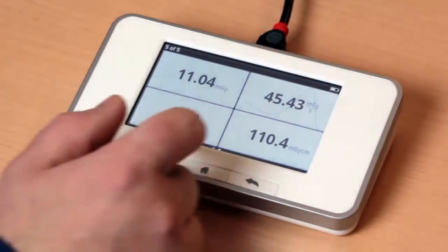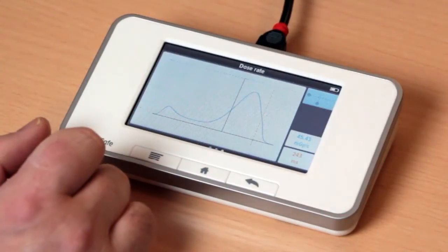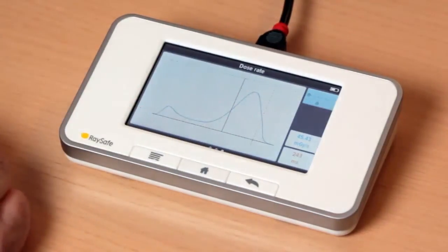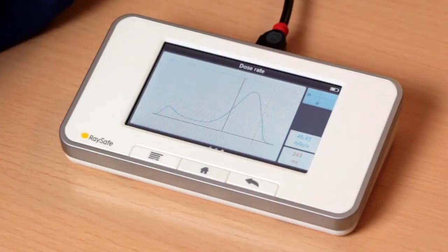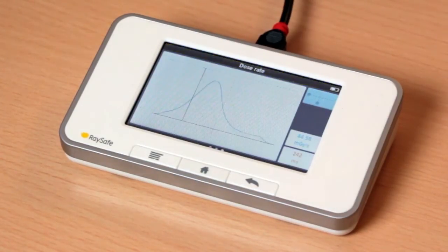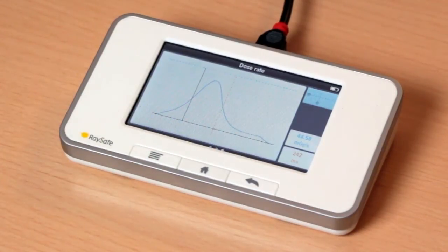If we look at the waveform, we see we have one major peak and one small peak, and in this case there is a chance that we pick up a little bit of radiation that is overlapping, because the radiation is slightly more than 360 degrees. So to be on the safe side, we make a new exposure. Now we only have one peak, so we can be sure that this measurement is within specification.